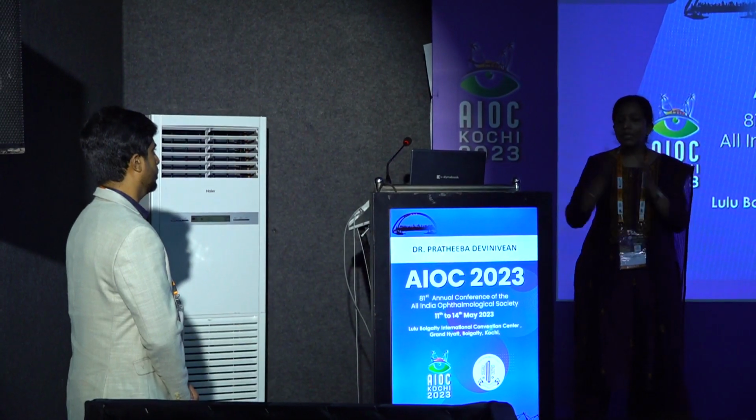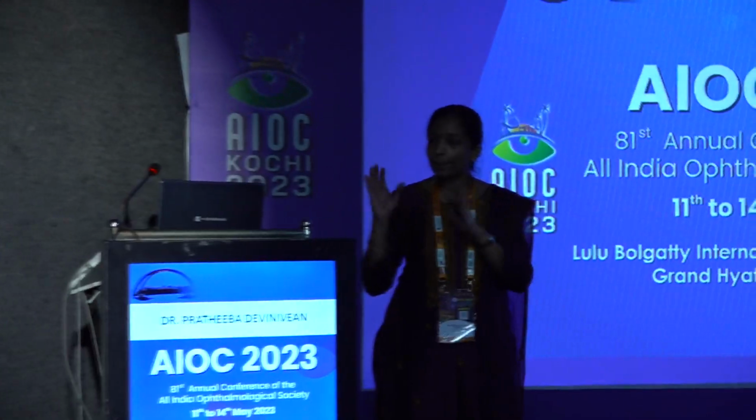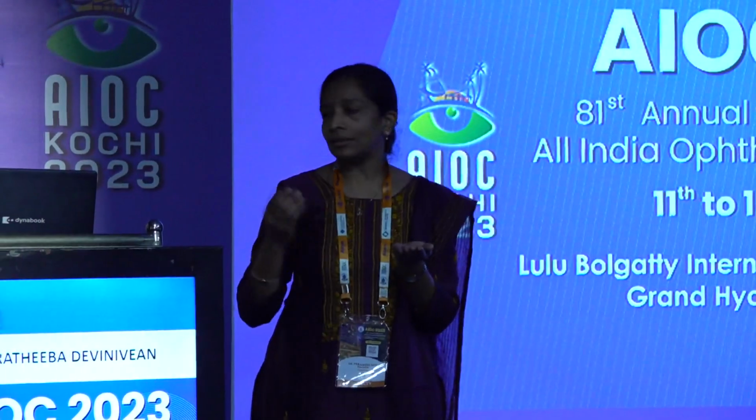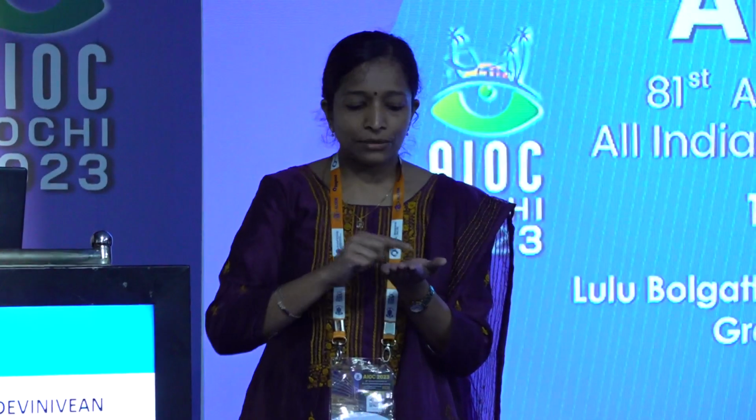They mirror the abnormal side to the normal side. So we will know the fracture; in every fracture, we will have the fracture in that model. Now the people who have the luxury of navigation can go ahead, but otherwise we can design the Medpore implant. We can cut the Medpore implant according to the shape and then sterilize it, and then we know the correct implant can be placed there.